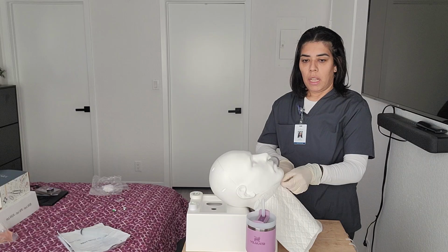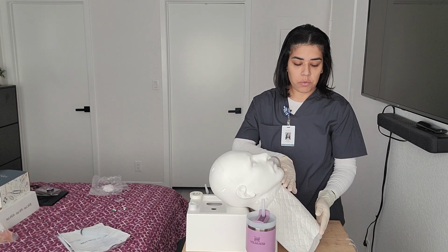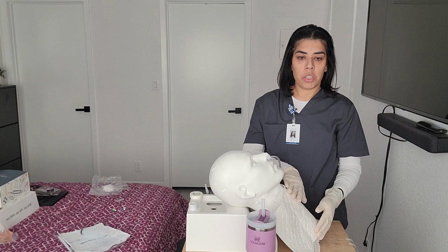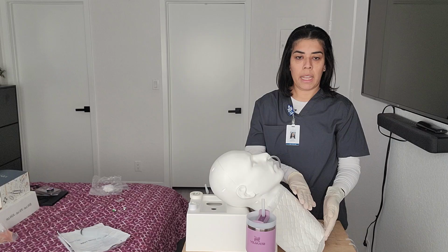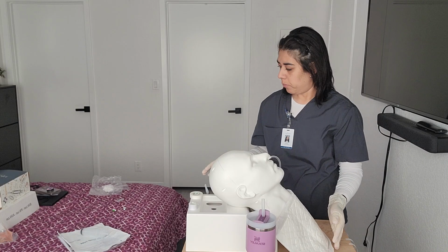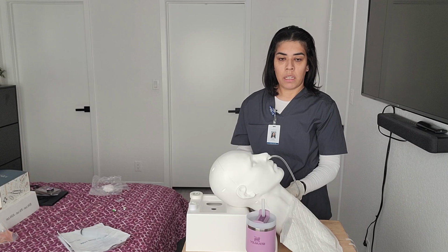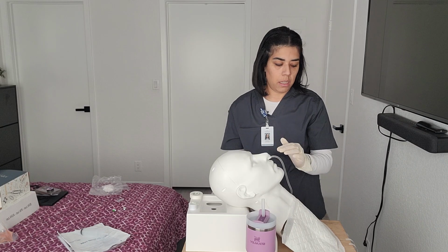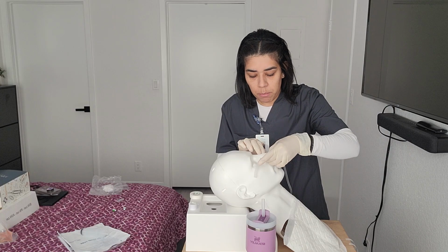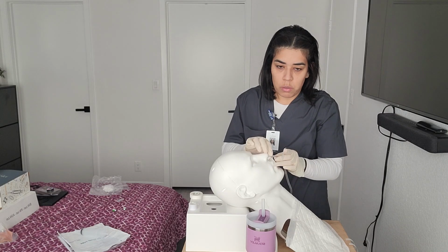Okay, so now the patient has gone ahead and to his x-rays. The x-rays have confirmed placement is in the correct area. So now what we're gonna do is go ahead and pin the tube to the patient's gown. All right, so we pin the tube to the patient's gown, and then we're actually gonna fix the tube here because this was just a temporary one. So we're gonna fixate the NG tube to the nose appropriately.